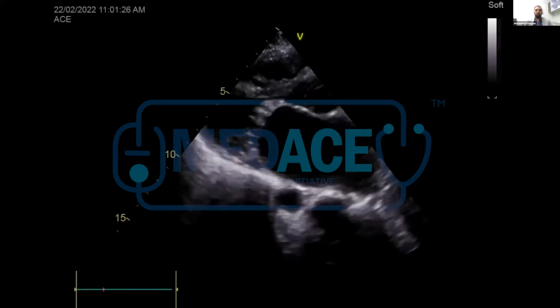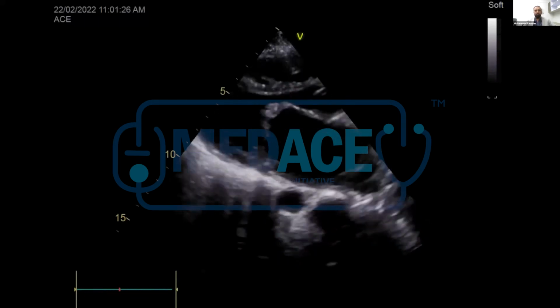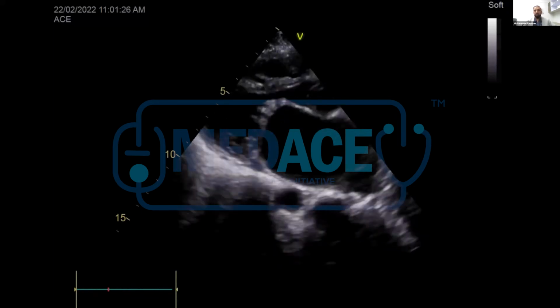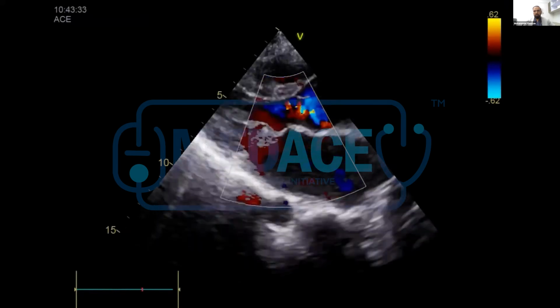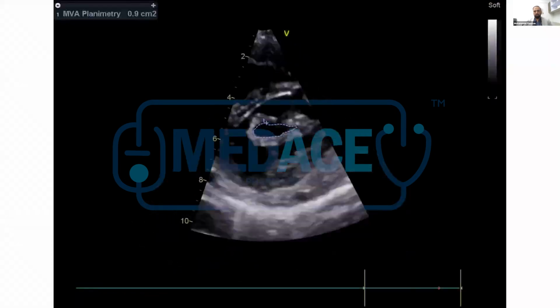We performed her transthoracic echo, and as you can clearly see, the mitral valve is rheumatic and thickened with restricted movements, and it is severely stenosed, apart from the dilated LA and prominent coronary sinus. On color Doppler interrogation, there is a trace of mild eccentric mitral regurgitation, and there are no other valve lesions.